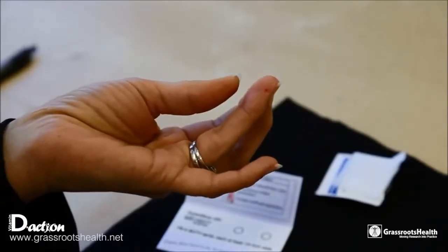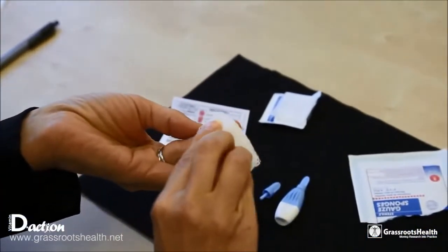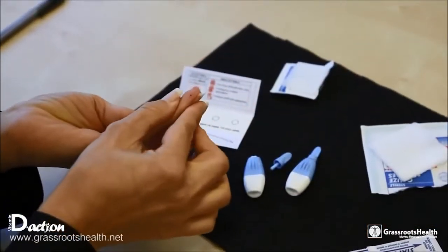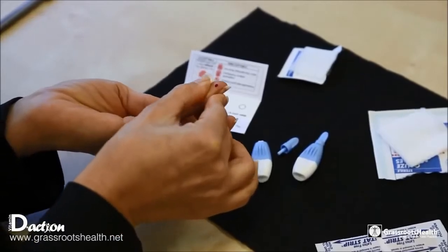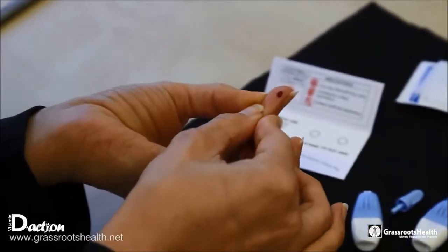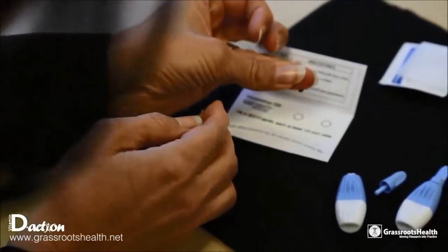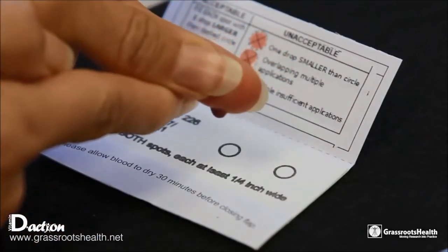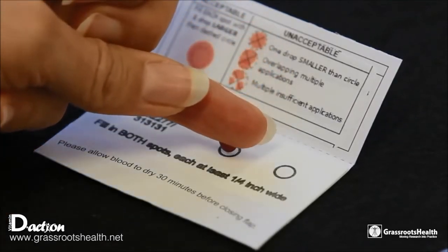At that point, you'll want to immediately wipe it with the gauze pad. This really is important and helps with the blood flow, and it helps start it. Periodically during it, if the blood isn't flowing, you can wipe again, and it helps with the blood flow. Now that you have wiped your finger with the gauze, you can see that the blood is coming to the surface, and all you need to do is gently milk it and hold it over the blood spot card and let it fall directly on the card.